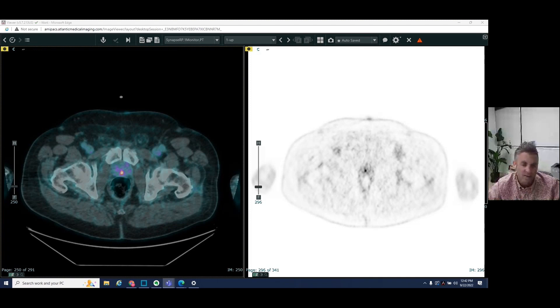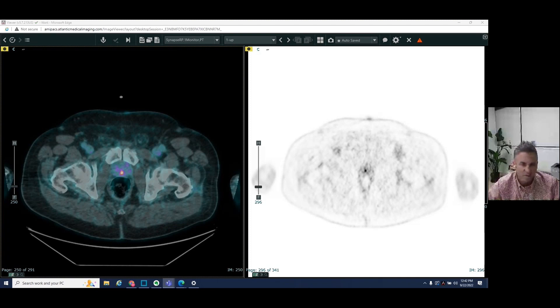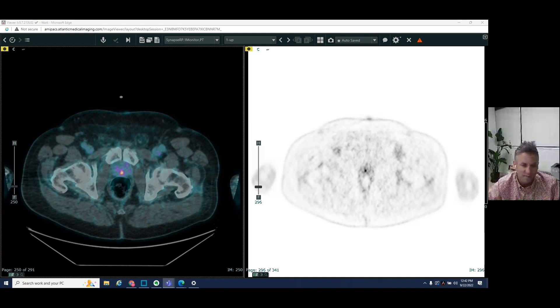So I thought I would take this opportunity to go through two PET CTs and talk about this new type of test and show you some images.